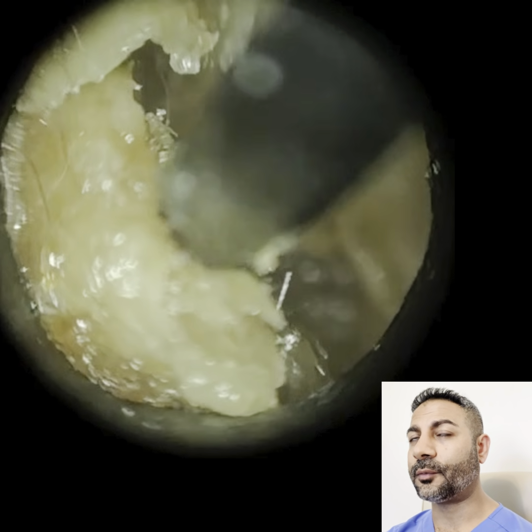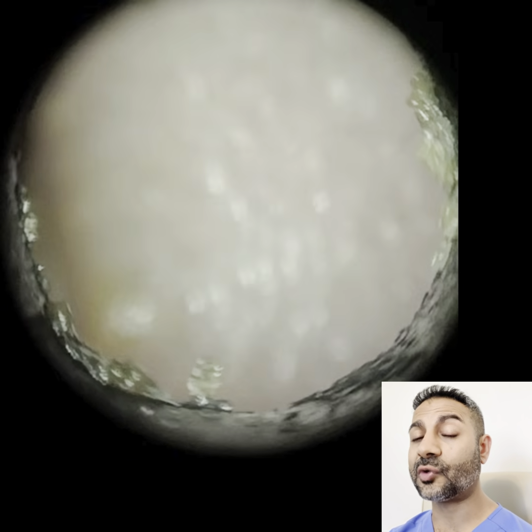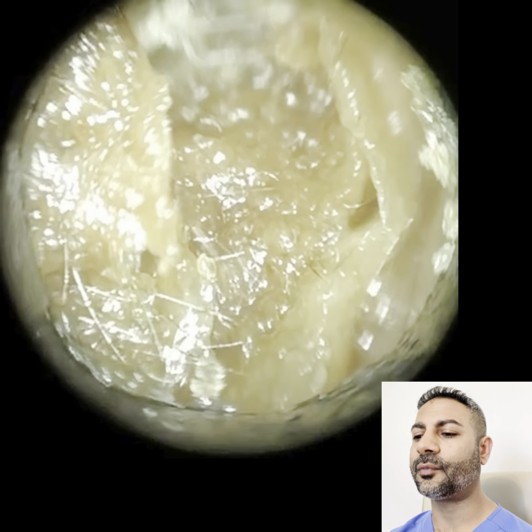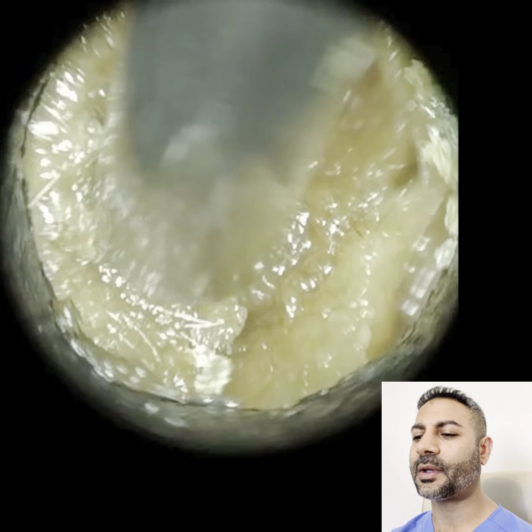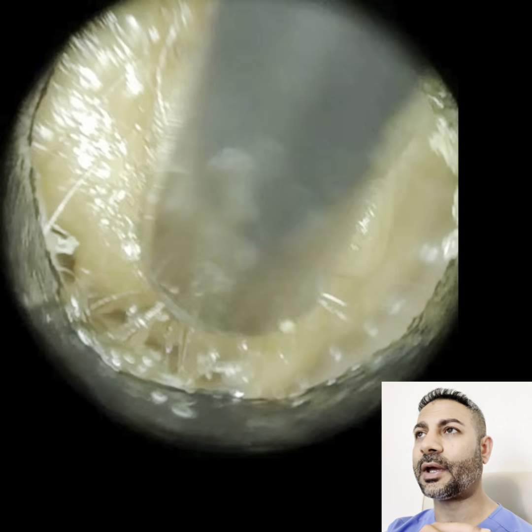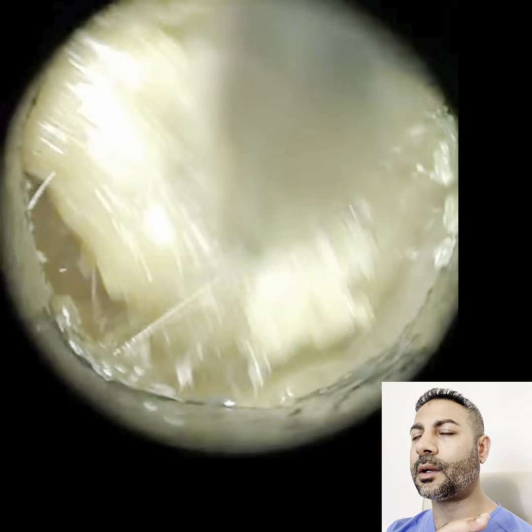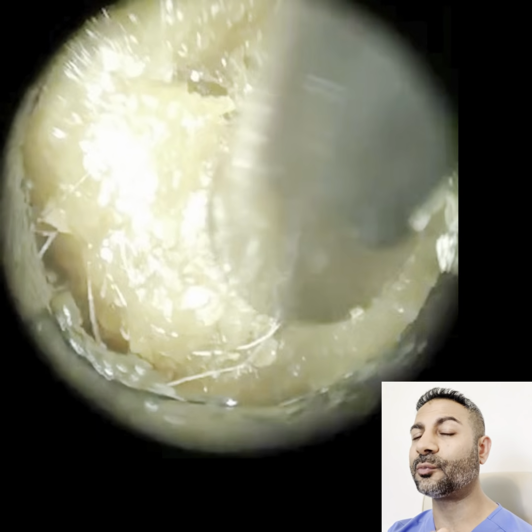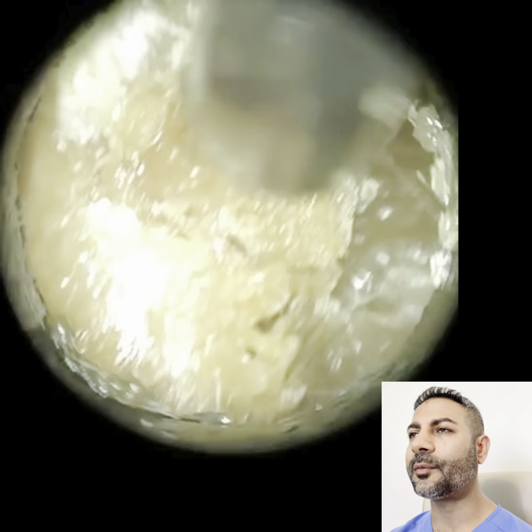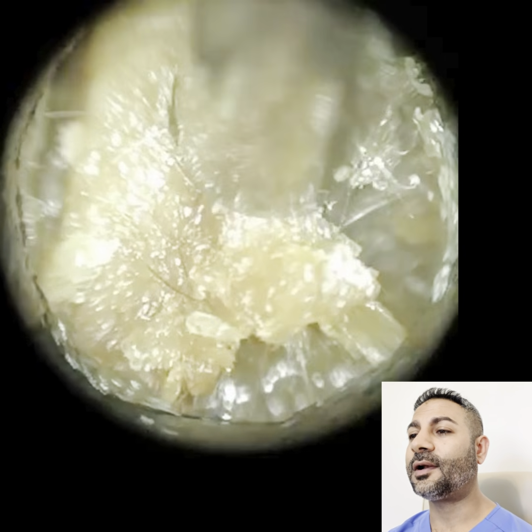However, following on from that, I did then do a test that we call tympanometry. Tympanometry measures the mobility of your eardrum, how mobile it is, and so how elastic it is. You can get an eardrum that, as soon as you change pressure, it vibrates, or it requires more pressure and it vibrates more gradually, so it's got a wider gradient. It also measures the ear canal volume and the pressure behind your eardrum. It's a very clever test.